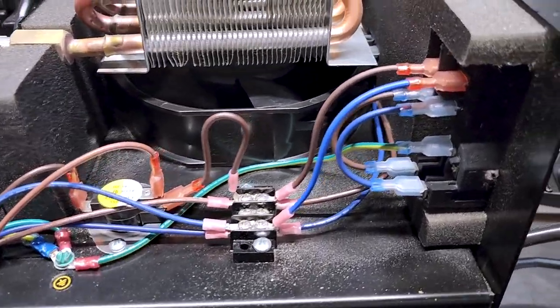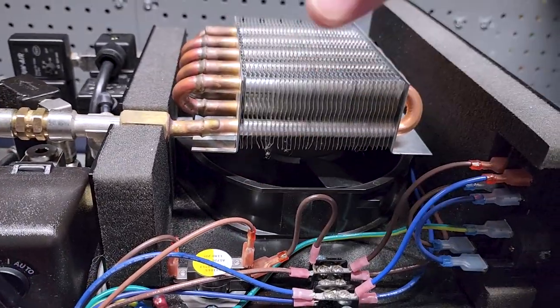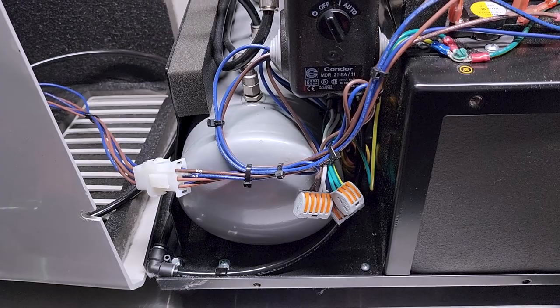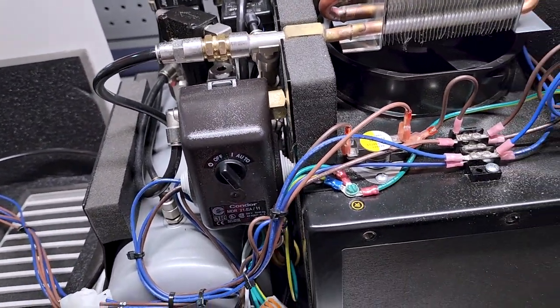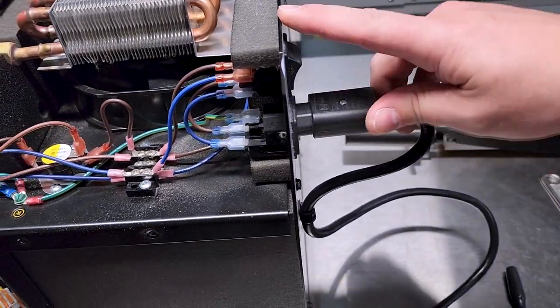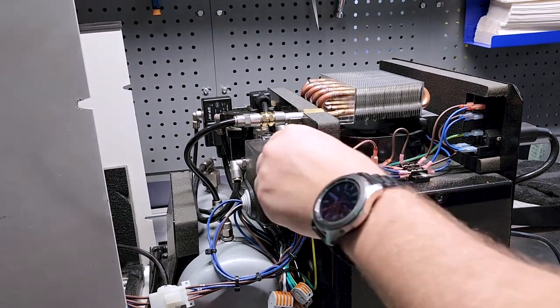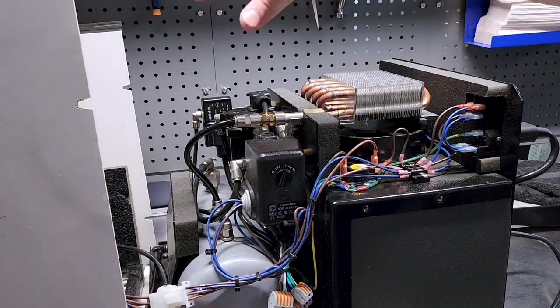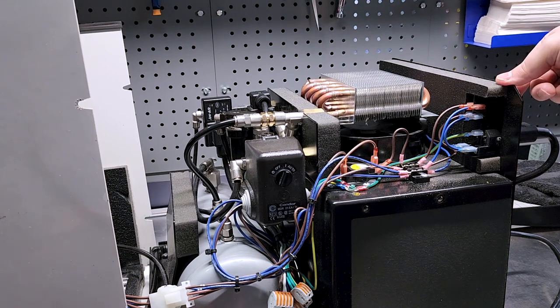I haven't cleaned her up yet. When we do PMs, we clean these guys right here, your condensers, and we do pressure checks and we check all the fittings. But this guy has got some extra problems. Let's go ahead and plug them in. I want you to pay attention to the sound it creates when it's powered up, because there is something going on right here, and I will show you what's going on in just a moment.